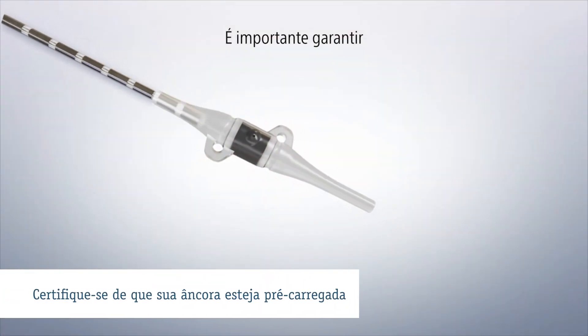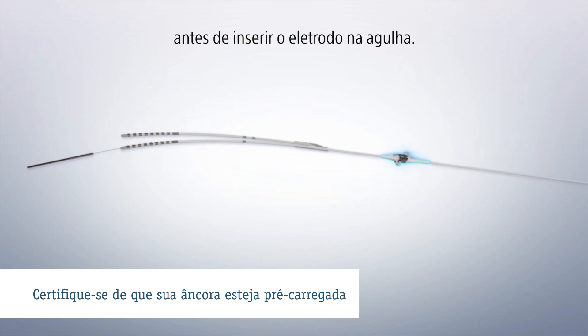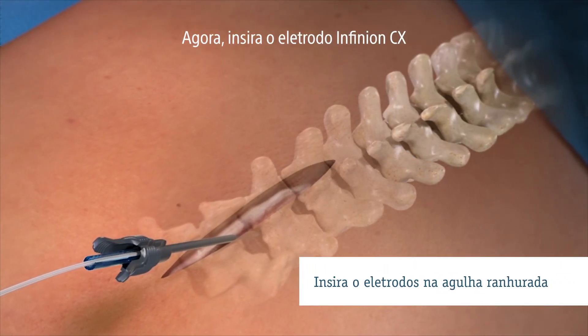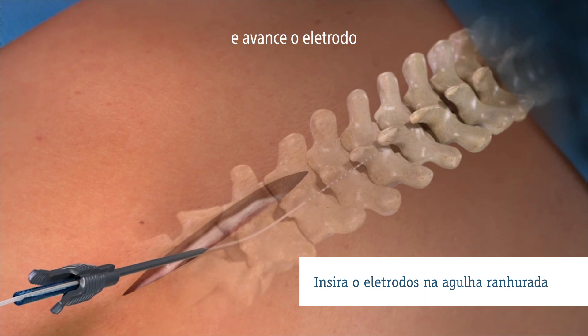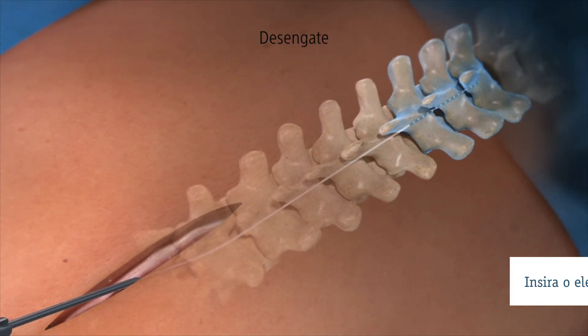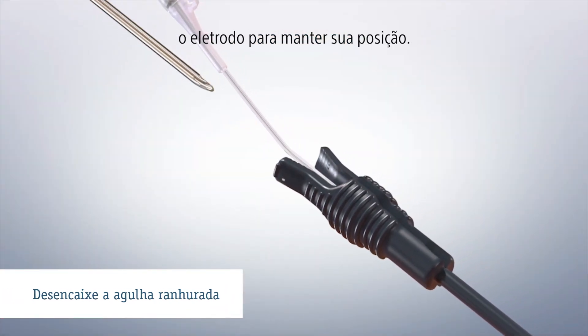It is important that you ensure your anchor is preloaded before inserting the lead into the needle. Now insert the Infinion CX lead into the slotted needle and advance the lead to the desired vertebral levels. Disengage the slotted needle while stabilizing the lead to maintain its position.